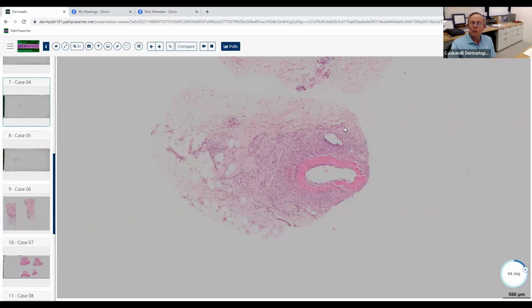But notice here, we sort of targeted the blood vessel. Blood vessels involved, inflammation is directly around the blood vessel. It's not spreading into the fat. Now, I don't understand why that happens. Why nodular vasculitis will give you the same pattern, but also destroys the fat and gives you lots of inflammation and draining ulcers. This disease gives you nodules in the skin. So I don't know why that happens, but that does happen.